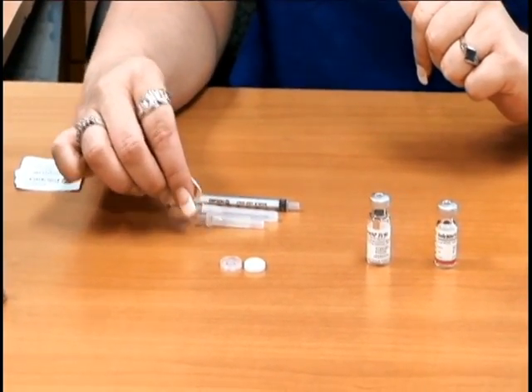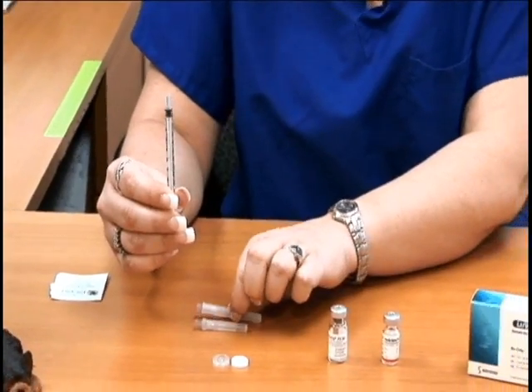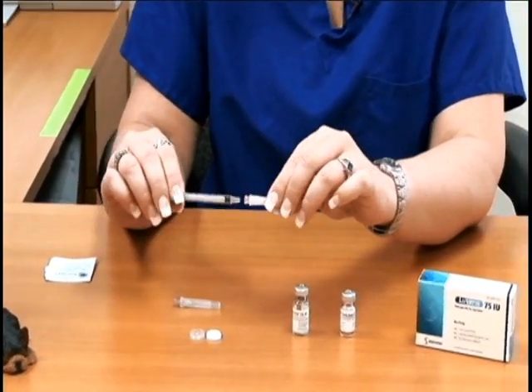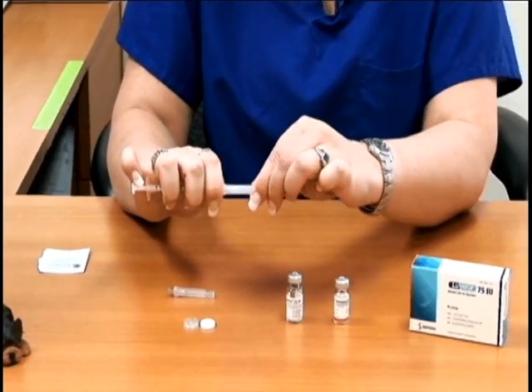The first thing you want to do is take your one ml syringe and apply the 18 gauge one and a half inch needle. You're going to remove the cap to the needle.